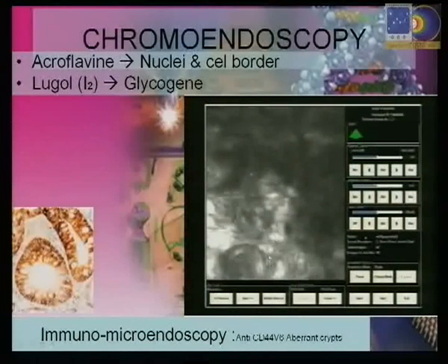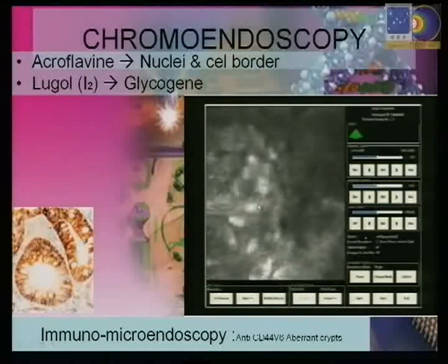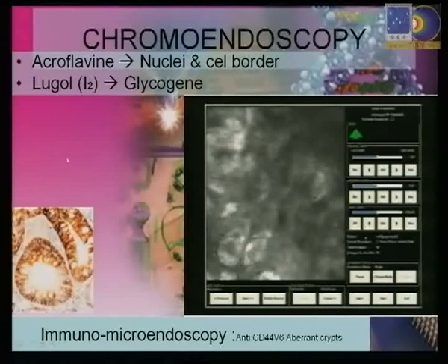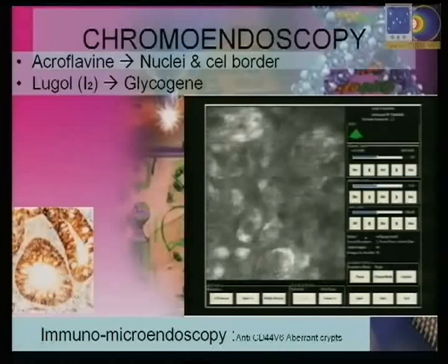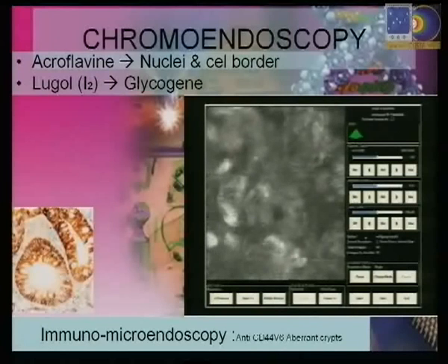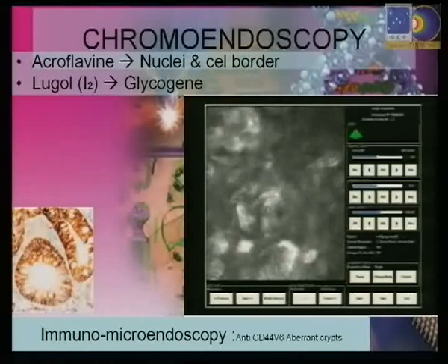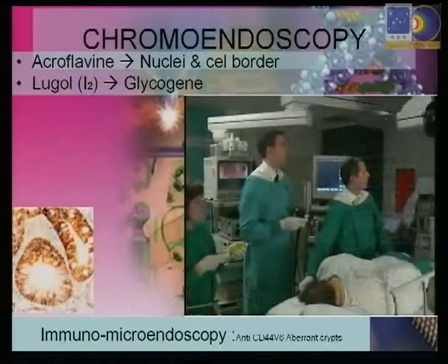Squamous epithelium is displayed as gray cells with low contrast. However, capillaries are brightly highlighted in the lamina propria. Here, irregular and twisted tumor vessels can be identified. Changes in vessel architecture are seen in real time, so that means that it's moving. It's not a very nice image, as you have seen previously. Different depths can be imaged using additional buttons of the endoscope control body.